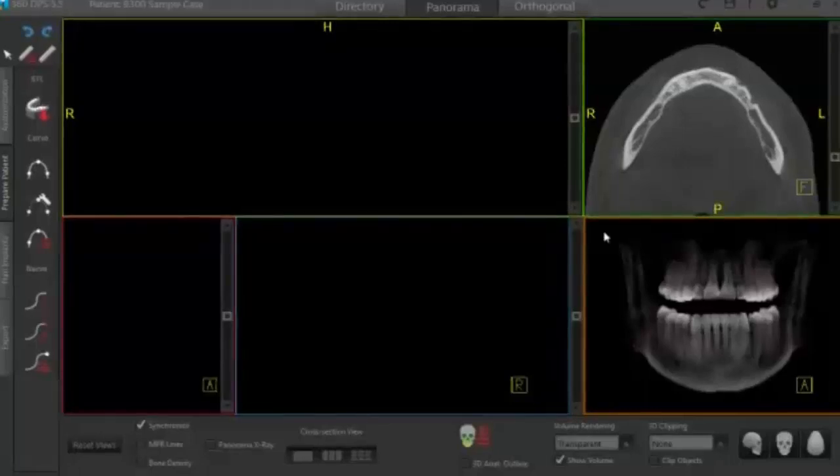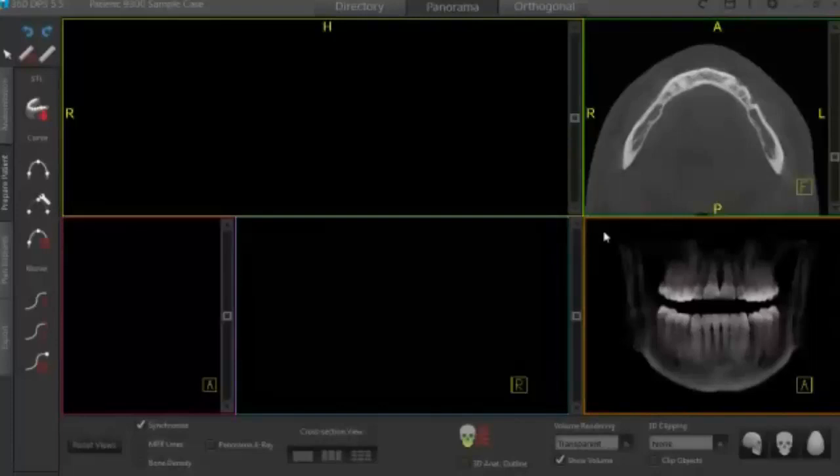Good afternoon. My name is Matthew Howell. I am the sales director here at 360 Imaging. Today I'll be demonstrating how easy it is to plan an implant case and order a surgical guide using our 360 DPS software with a CareStream 9300 scan and a Zimmer implant.